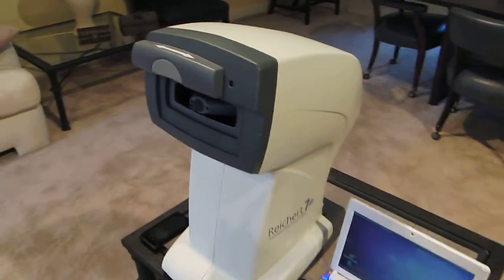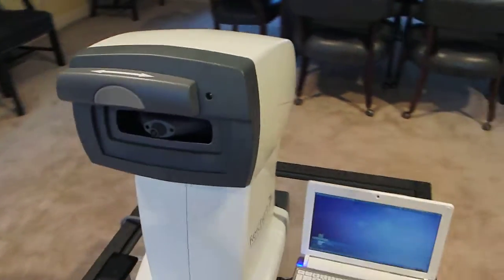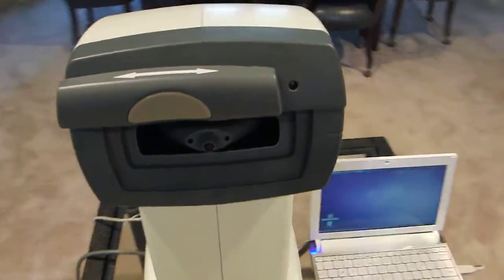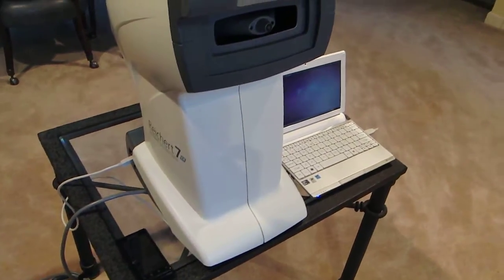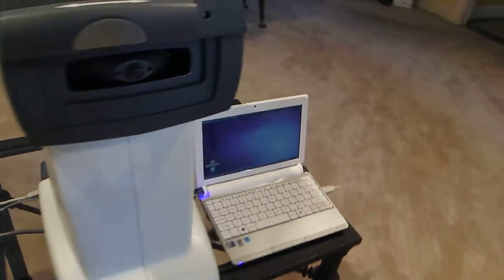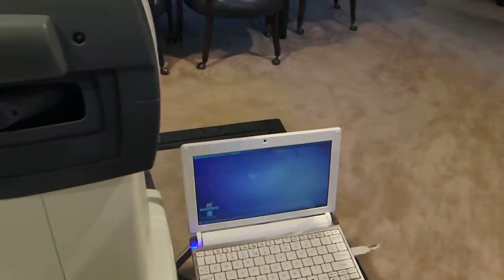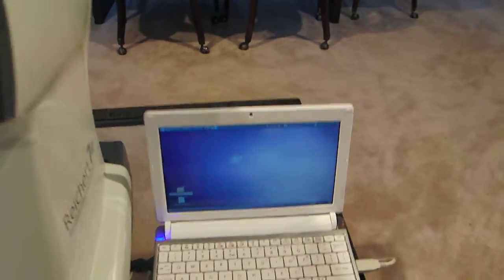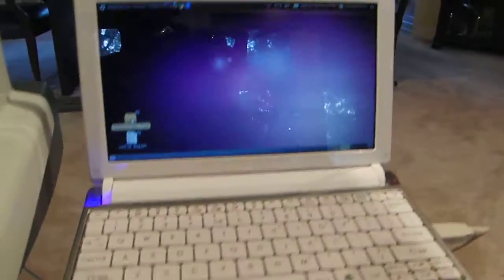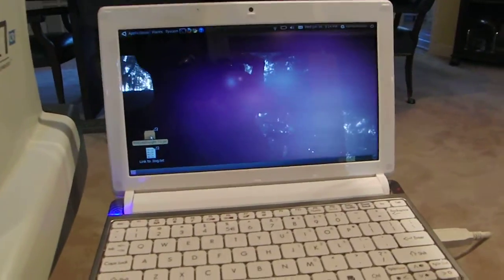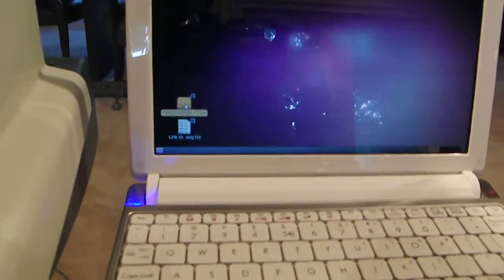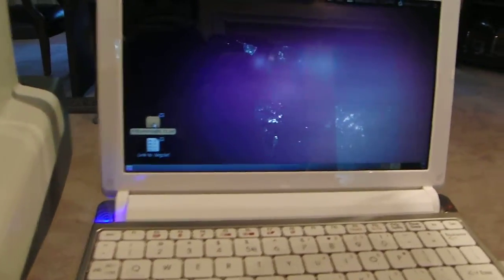So here we have the tonometer sitting on a low table. We have the little netbook computer. On this computer we have the FitEyes Insight application installed.